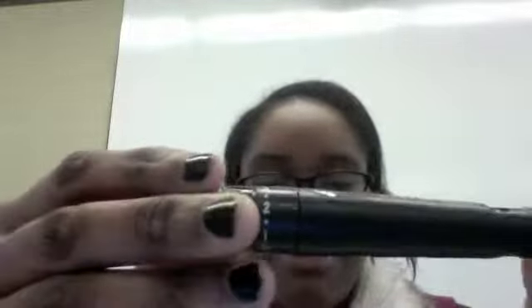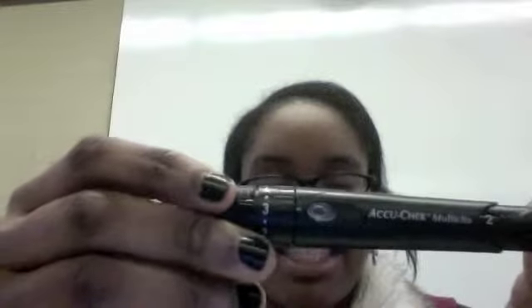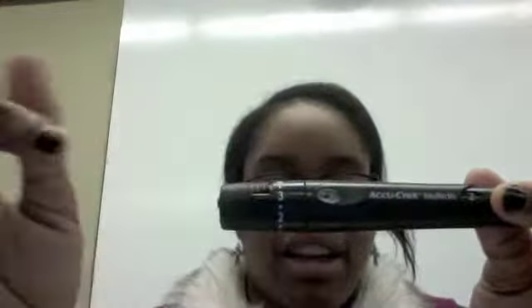Alright, so this is my handy dandy test poking device. It's very easy to use. As you can see, there's going to be a yellow color right here, meaning that it's ready. So I haven't been able to do it yet because this was still from the last test. I showed you that. Alright, so when you do your test strips, I recommend preparing it before you actually get your finger ready for it.